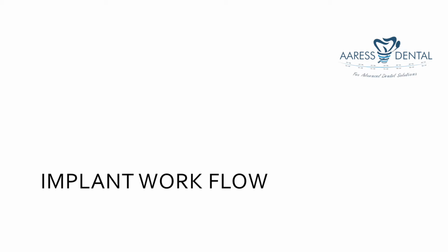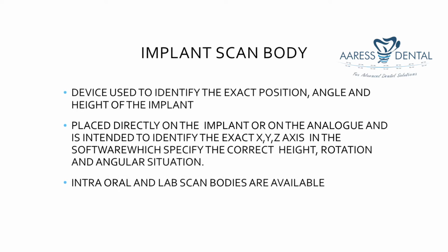Now we'll see the digital workflow for implant cases. Before going to the digital workflow for implants, we should know something about implant scan bodies. They are the devices that are used to identify the exact position, angle, and height of the implant. They are placed directly on the implant or on the analog and are intended to identify the exact XYZ axis in the software, which specify the correct height, rotation, and angular situation. Intraoral and lab scan bodies are available.